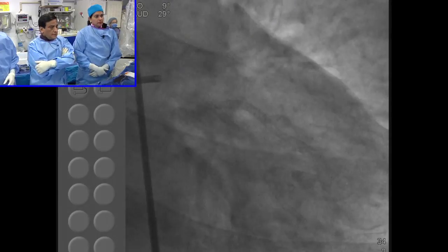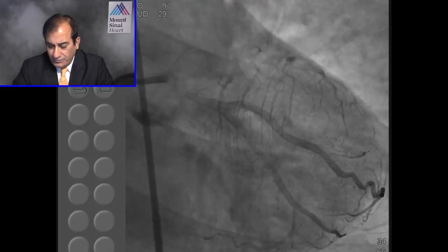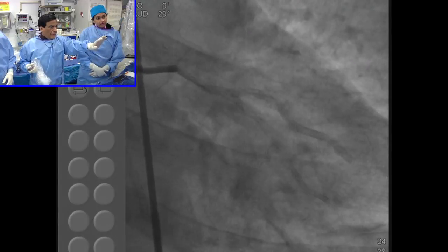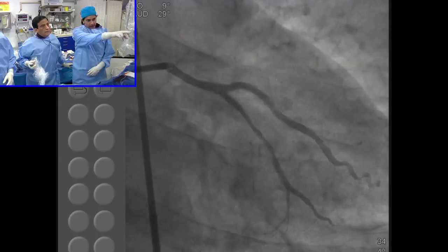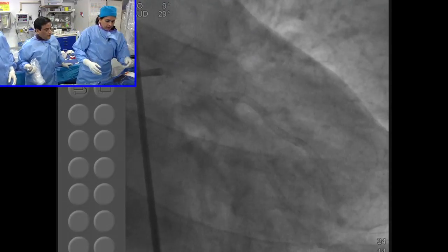So, Samin, do you want to tackle your questions first? Quickly, we end up because it looks good. The only question is, do you want to do a little balloon dilatation of the OM2? Is that the plan? No, not OM2. I'm worried about the underexpansion of the first OM1 stent. Good. So we have a 2.75 balloon. We can post-dilate there.